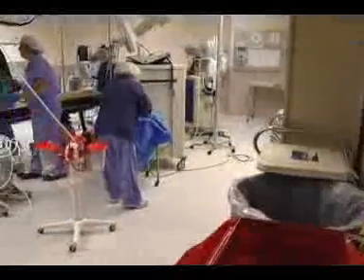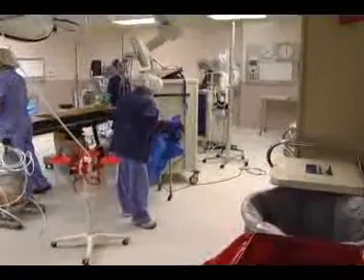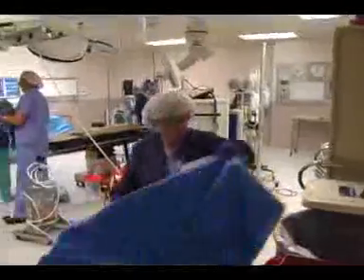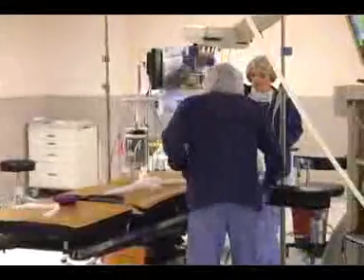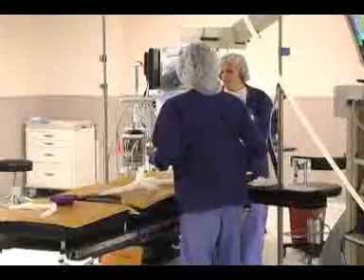After every surgery is completed, the entire room is stripped of all disposable items, and every surface and item in the room is subject to cleaning in preparation for the next patient.